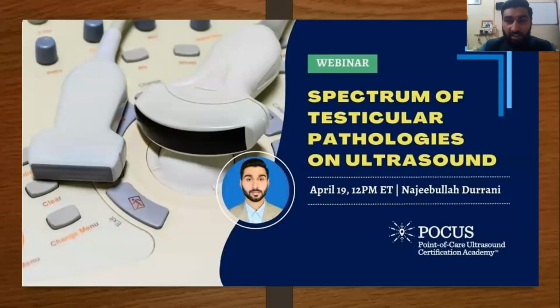Welcome. We have a very important topic, the testicular pathologies on ultrasound. Before starting the presentation, let me tell you some facts about the testes. They are also called the sperm factories, homologous to the ovary in females. They produce testosterone, which helps to develop muscle, deepening of the voice, and many other important tasks. They produce about 1,500 sperm every second, almost 90,000 sperm every minute.